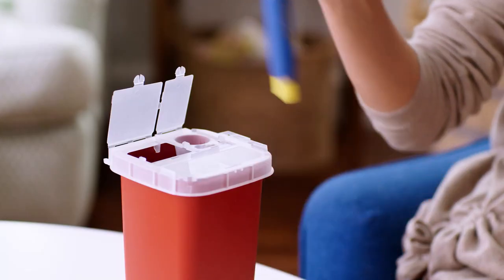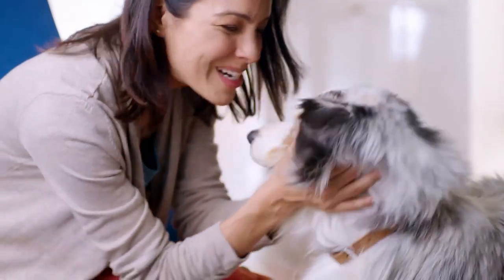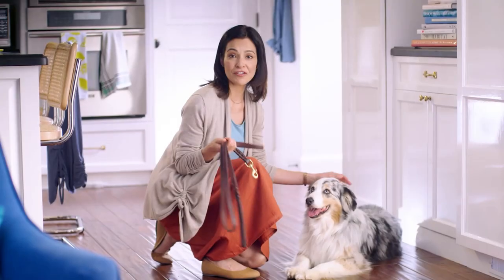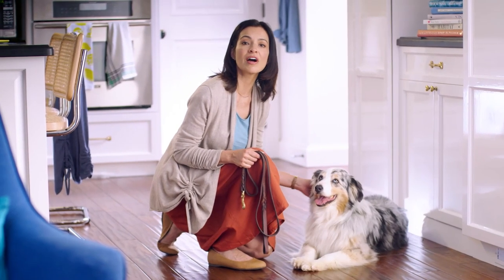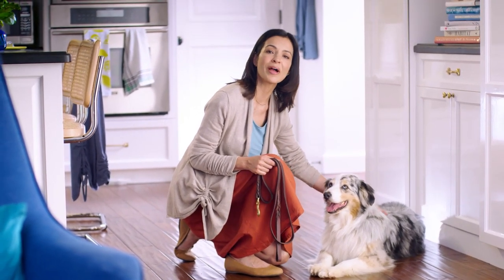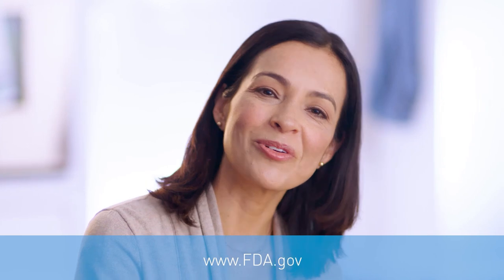Now, it's really important to dispose of the auto-injectors and the cap safely after use. The sharps can be dangerous to others, like children and pets. There are different ways to get a sharps container — you can find them at most drugstores, or you can contact Amovig Support Services for help. If you want to know more about sharps containers and needle disposal, visit fda.gov and search sharps containers for more information.